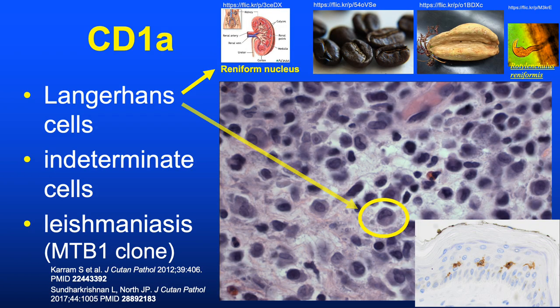There are hundreds of CD markers. CD1A is a marker for Langerhans cells and also labels indeterminate cells; one clone also highlights amastigotes in leishmaniasis. Langerhans cells have a bent or reniform nucleus—shaped like a kidney, sometimes like a coffee bean.